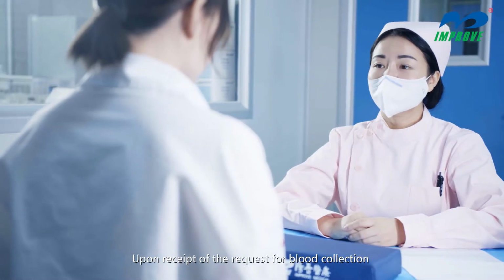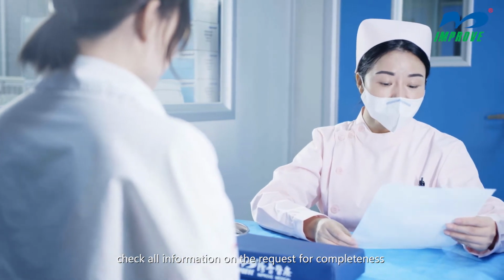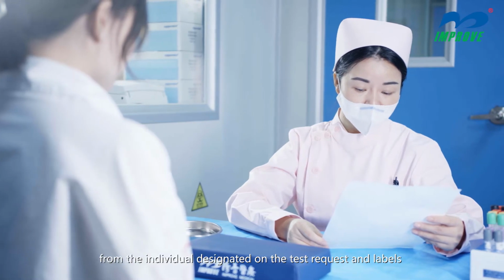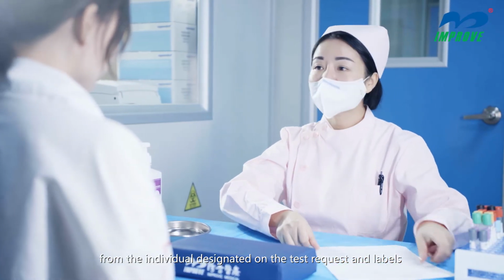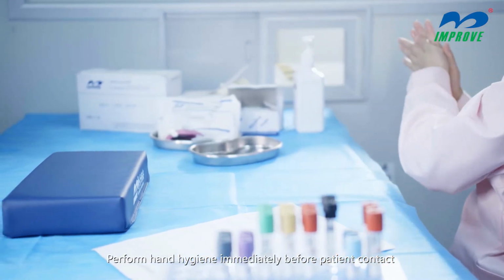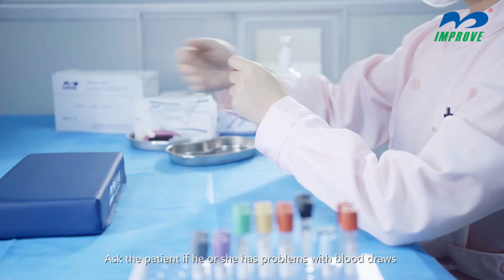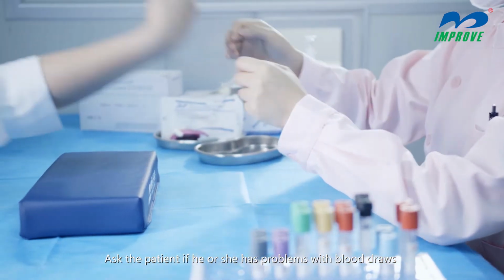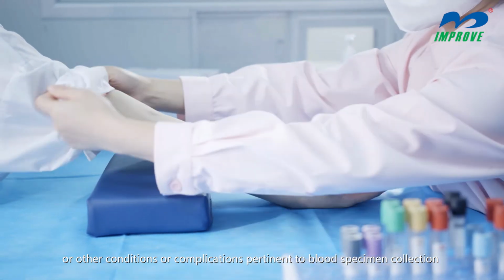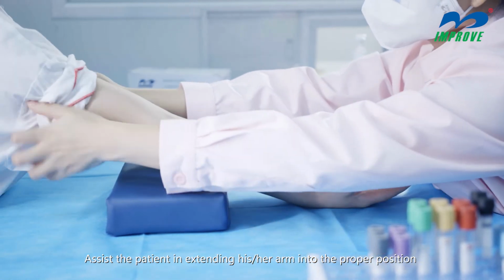Upon receipt of the request for blood collection, check all information on the request for completeness. Ensure that the blood specimen is drawn from the individual designated on the test request and labels. Perform hand hygiene immediately before patient contact. Ask the patient if he or she has problems with blood draws or other conditions or complications pertinent to blood specimen collection. Assist the patient in extending his or her arm into the proper position.